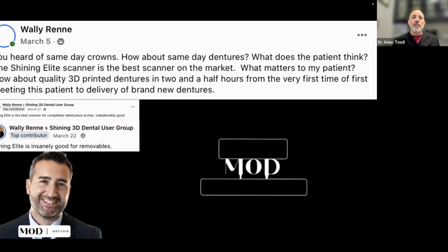We don't have to take an impression and scan an impression to make a denture. We can use this device along with proper retraction. That's going to be the main thing. Proper retraction, so we can capture all the vestibules. A lot of times, this does mean that we have to turn the artificial intelligence off on the device so that we can capture the mucosal area. The scanners like to block that out, but this shows us that we can do this accurately. And if he gives a thumbs up, then you can take that to the bank because he's very, very hard on products, especially new products.